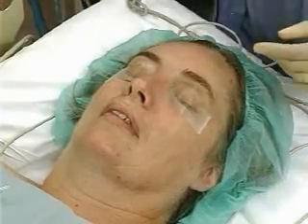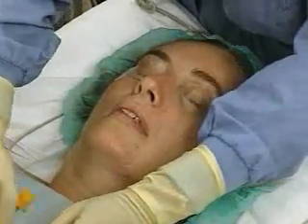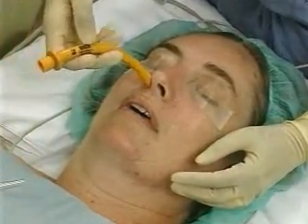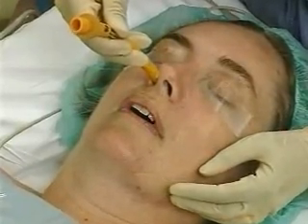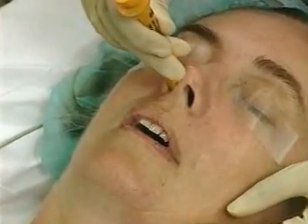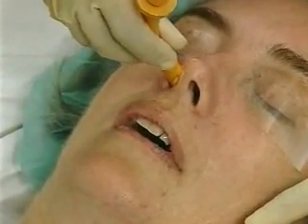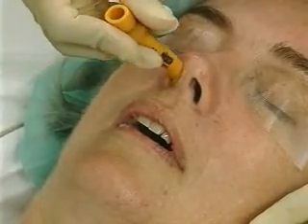Patient positioning may be supine, lateral, or sitting. Pass the airway gently into the nose with the concave side facing the hard palate. If resistance is met in the posterior pharynx, bend the tube 60 to 90 degrees with gentle pressure and proceed down the pharynx. If the airway will not pass with moderate pressure, it may be helpful to rotate the airway 90 degrees counterclockwise and then rotate it back to the original position as it makes the bend down the pharynx.